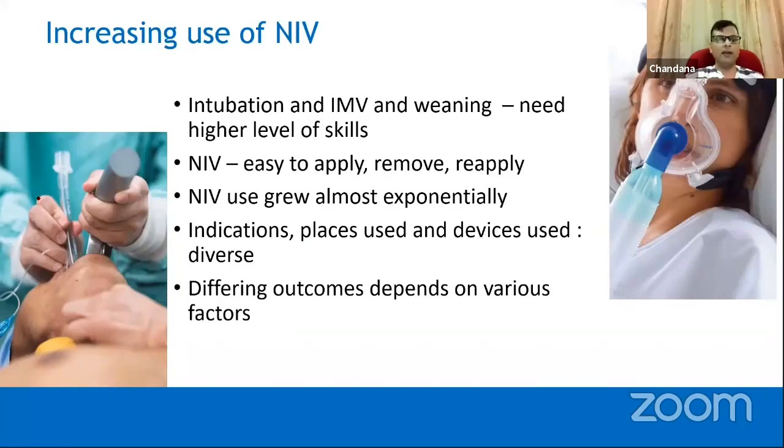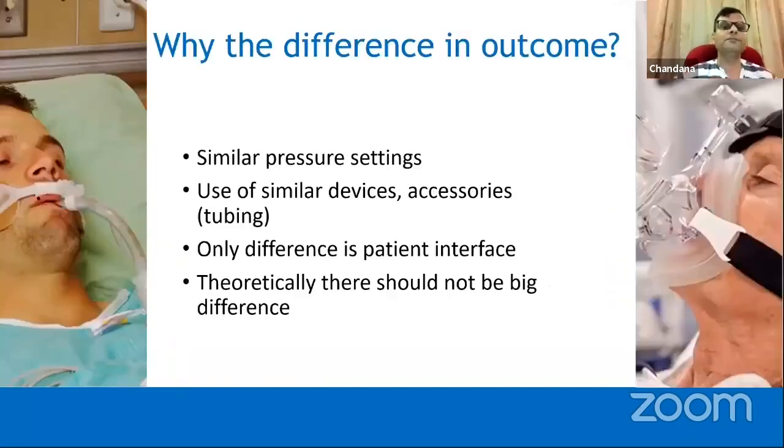But at the current moment, this is one of the most useful devices because of the lack of skills to intubate and the lack of places to keep these intubated patients. So NIV is indicated at the moment in COVID because of this desperate situation.